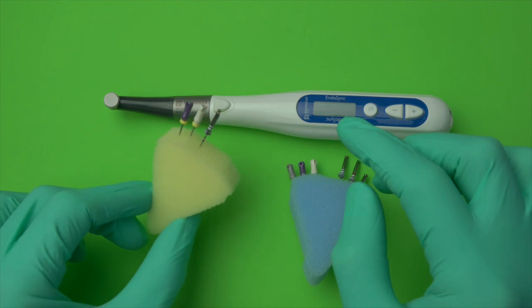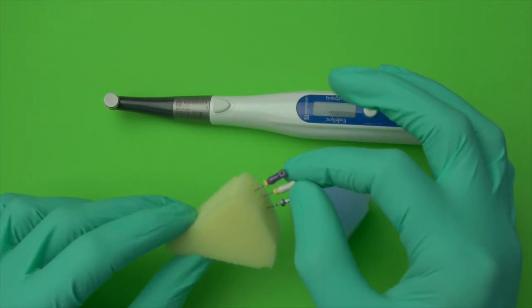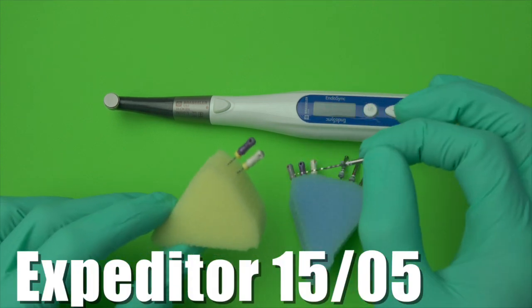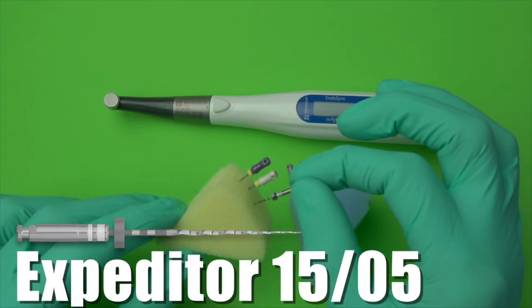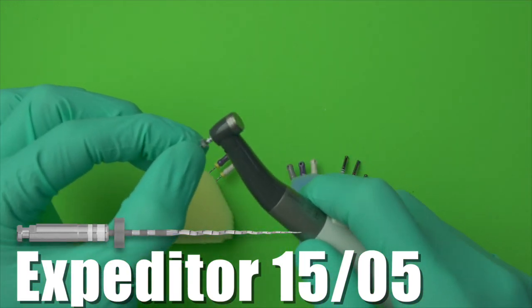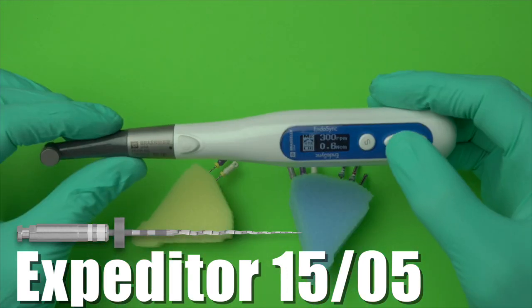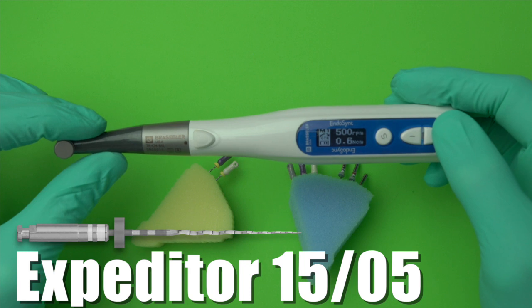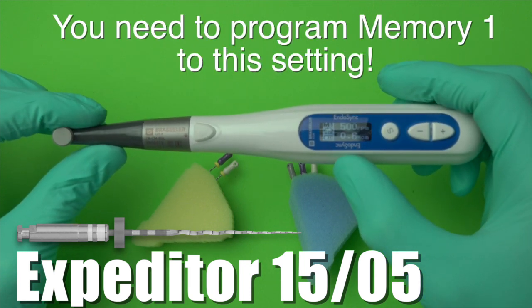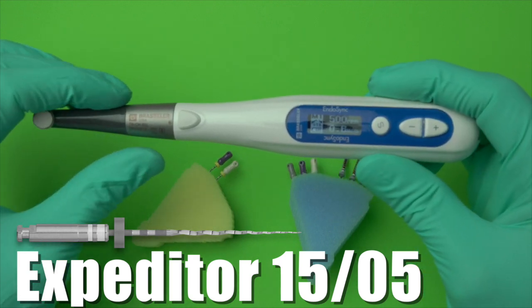We start the case, do the access opening, do my size 10 and then a 15, confirm that it is a basic case, and use the expediter to get down — using the EndoSync. We use the proper settings to get down to the apex: I use memory 1, which is 500 RPM at 0.6 newton centimeters with OTR. As I approach the estimated working length from the radiograph, I switch to memory 2, which is 300 RPM.